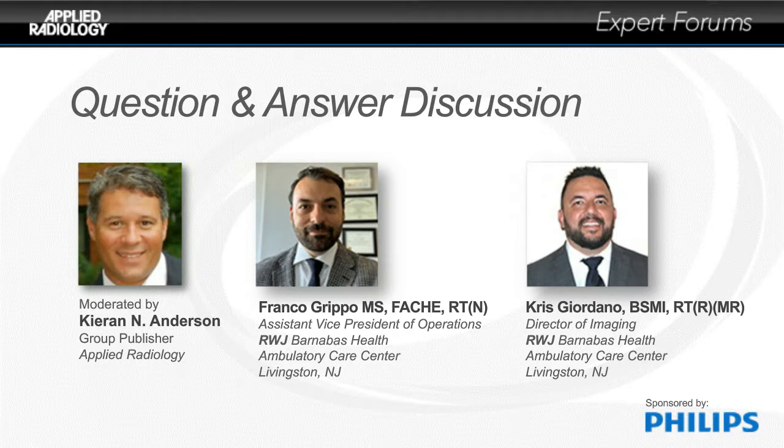Second question about the pacemakers: we do scan MR conditional pacemakers, as long as the manufacturer has the clearance at 3T or for the conditions that need to be met. The simplest aspect is entering those factors into the ScanWise at the point of registration, as I said earlier. That gives us total confidence that no matter what the radiologist plans protocol-wise, we don't exceed the safety parameters, the speed limit, if you will, set by the manufacturer.